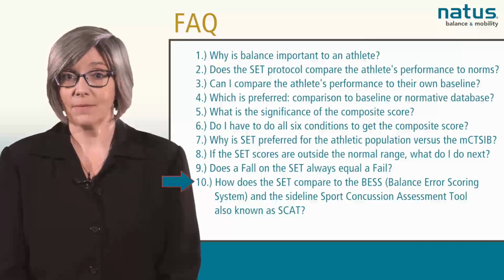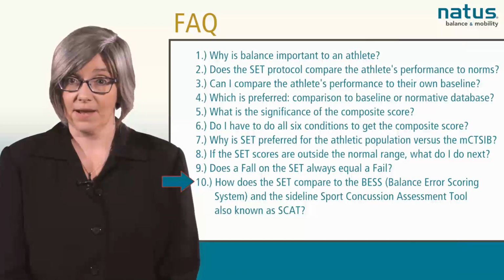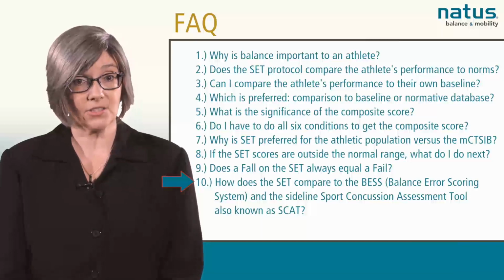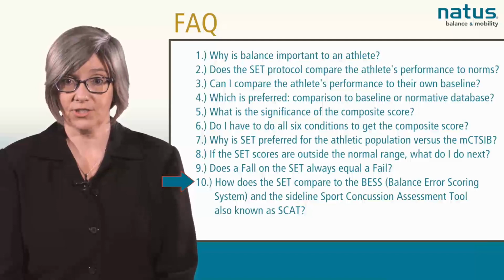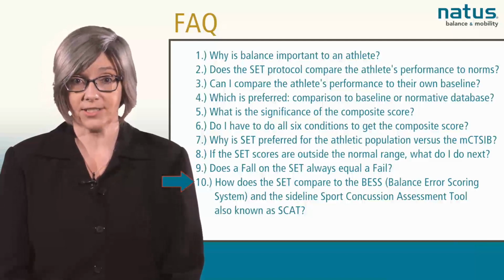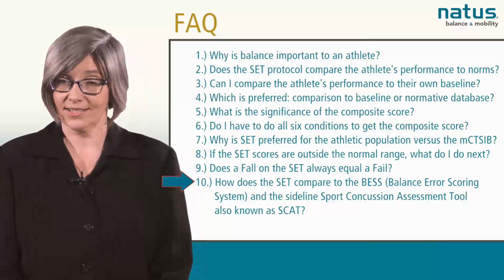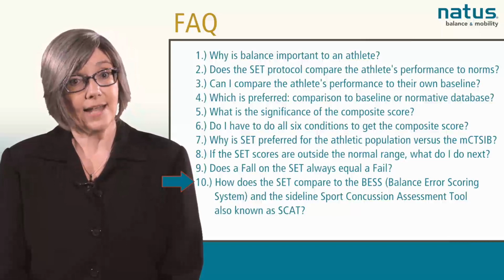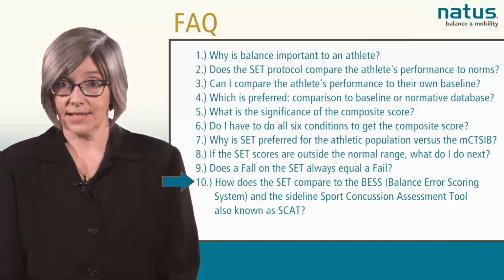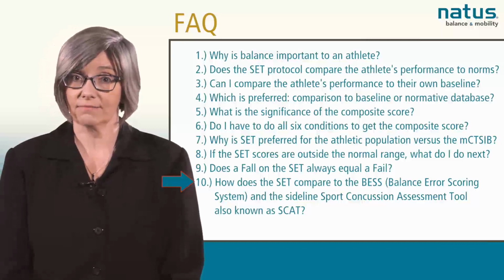The BESS, the Balance Error Scoring System, is a valid observational method designed to assess balance control in athletes in the absence of standard objective measures, such as the Sensory Organization Test, the SOT, or the Stability Evaluation Test, the SET protocol. The BESS is a non-computerized subjective assessment scored by the number of errors counted by the clinician.